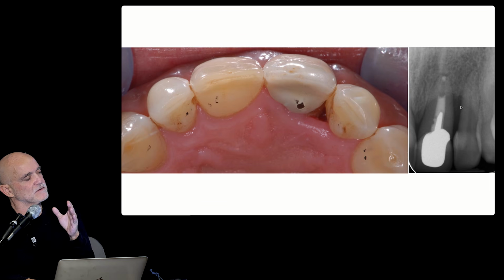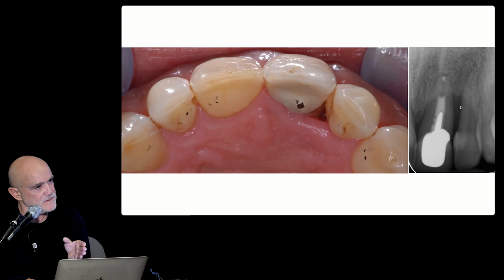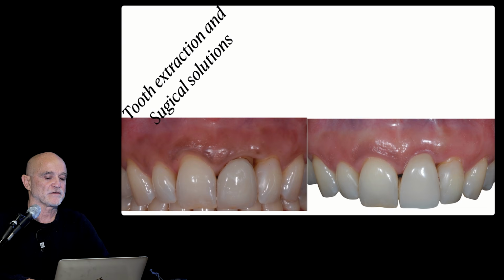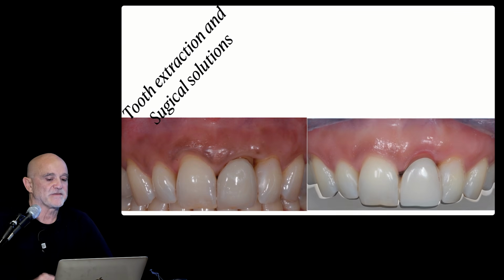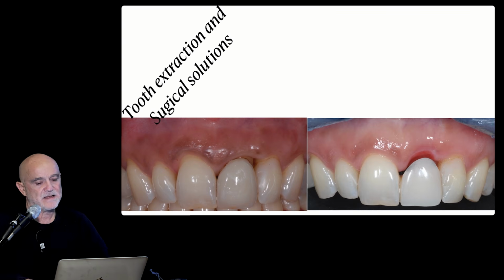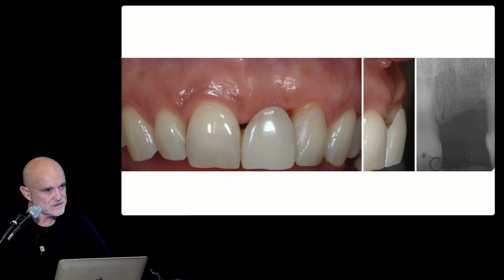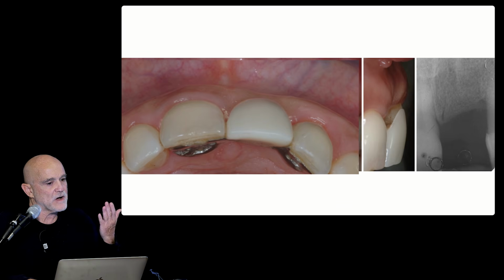So the only way to solve root proximity in the presence of the bony defect, when there is no supracrestal soft tissue anymore, is to extract the tooth. Place a Maryland, reduce the Maryland, leave soft tissue maturation and hard tissue maturation for 6 months. You see that now we have soft tissue. And the soft tissue, we know how to manage the soft tissue of the edentulous site.